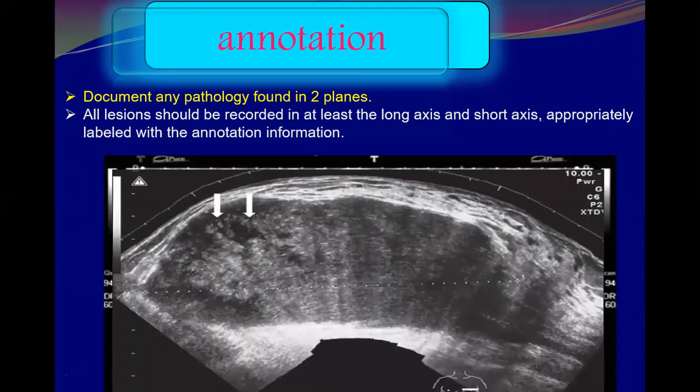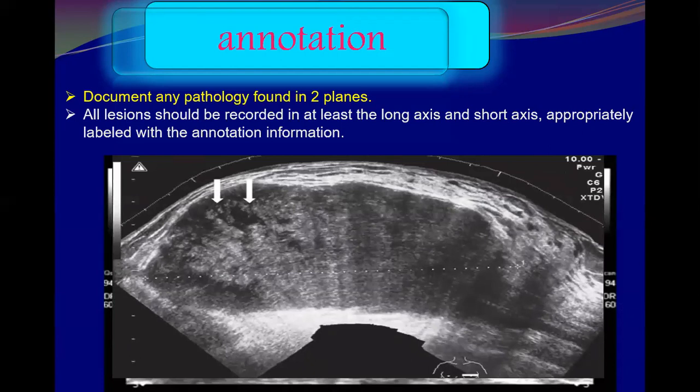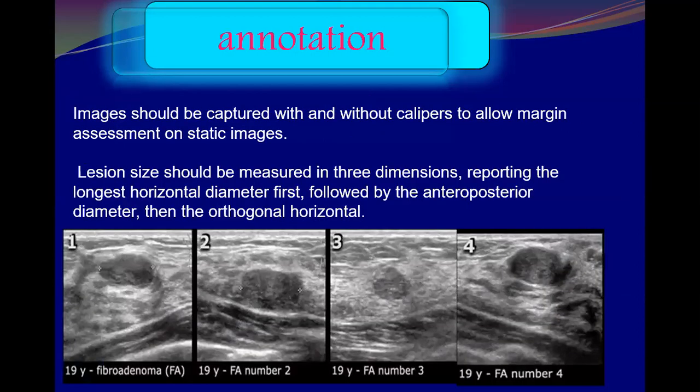And in case of larger lesions, we can use which view? This view now? Panoramic view. Extended view. Excellent. This is a panoramic view. This is a panoramic view. Then we can use it for large lesions to get the measurements.